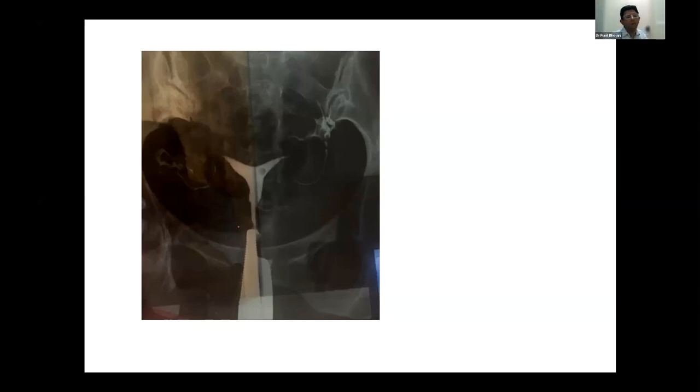Now, can anybody tell me what is seen over here? Take your time. I think all of you can see this. Again, HSG with the Colvin's cannula. What do you see? Tubal block, say better, more than that. Forget the comment, arcuate uterus, more than septum. There is no block. Where? What is this? It's a solitary filling defect.